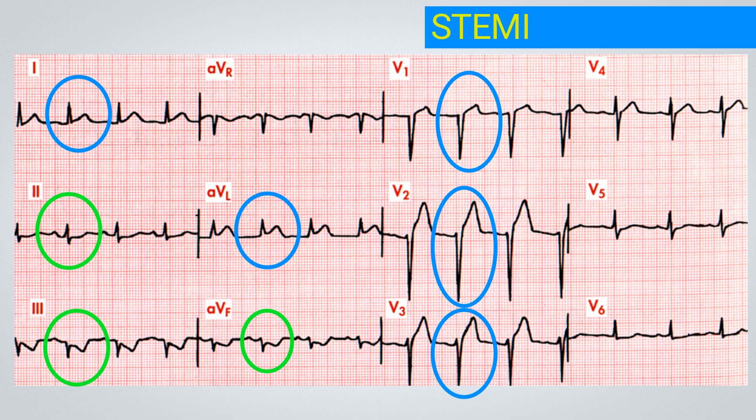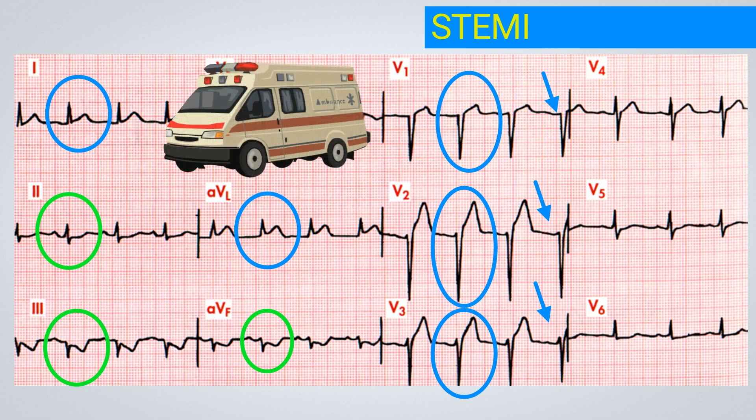We can already notice from V1 to V3 that there is a reduction in the R-wave amplitude, which means the QRS complex is not progressing as much, likely due to the onset of wall necrosis. The main diagnosis is an anterior acute myocardial infarction with a less significant lateral component. This patient should be prioritized for referral to the emergency department and immediate care.